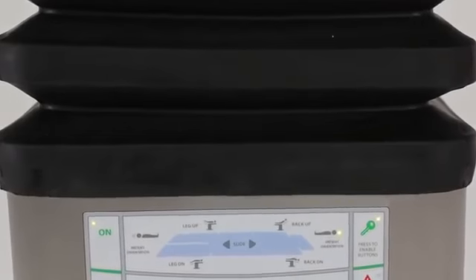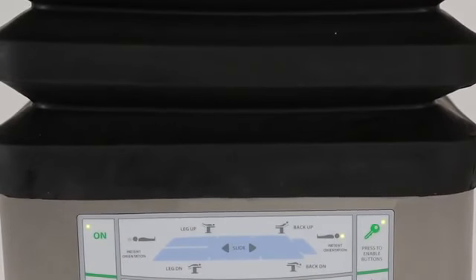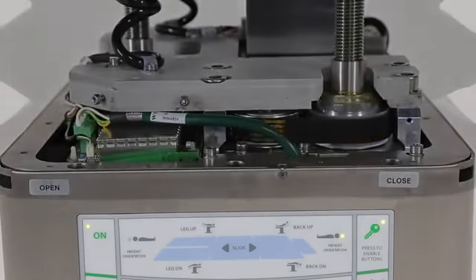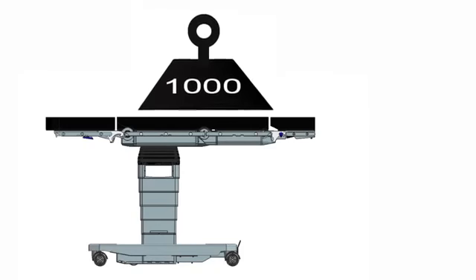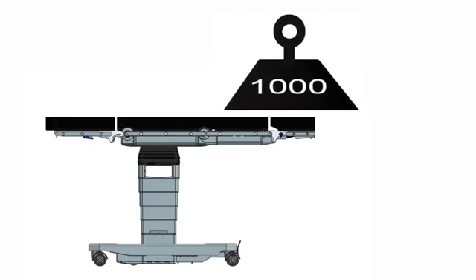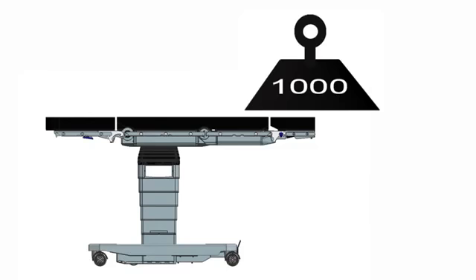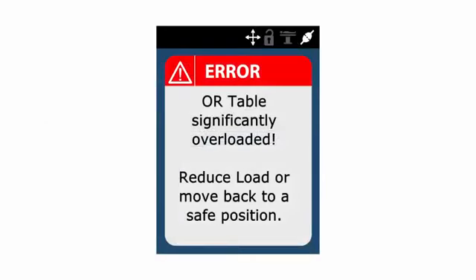Below the stainless steel exterior are many safety features that enable you to focus on patient care, not the table. Innovative force sensor technology alerts the user when the patient and or table are in a compromising position. This reduces risk of tipping or table failure, making the TruSystem 7000 the right choice for bariatric patients of up to 1,000 pounds.